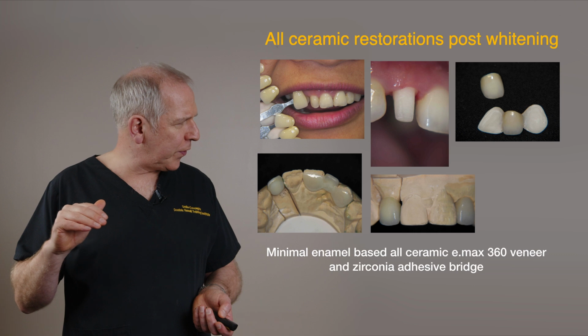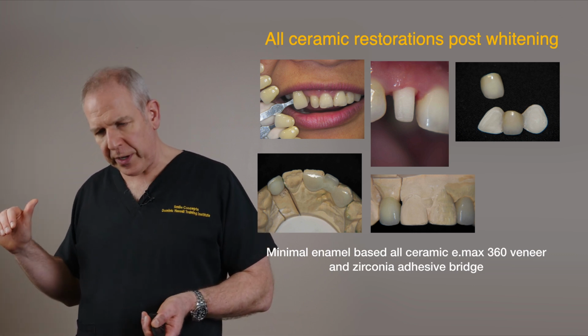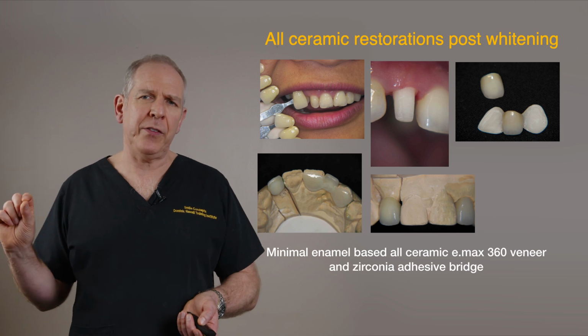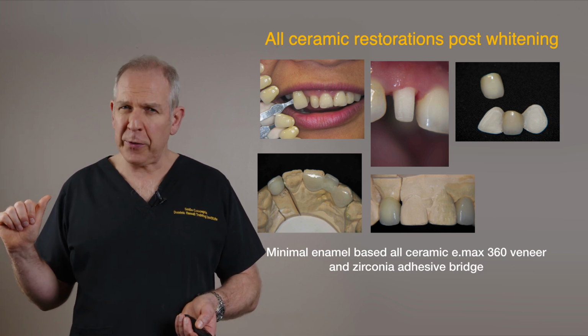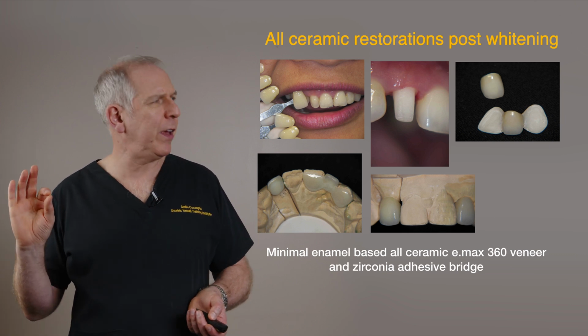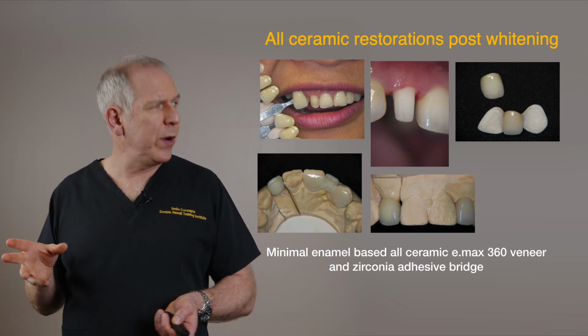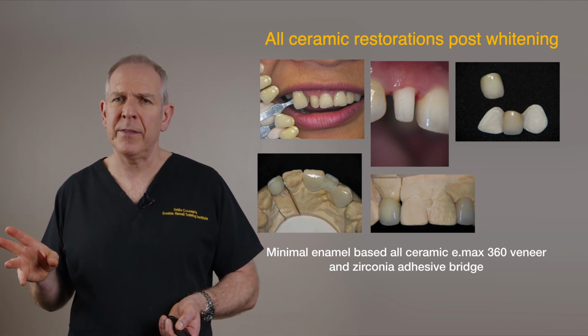So in the final slide, I'll show you in a bit, but what we did with the central incisors was we built up the incisal edges with some Venus Pearl. And within the Venus Pearl, they have that blue tinge composite, which builds those up beautifully. And then we went for a zirconia bridge on the left-hand side.